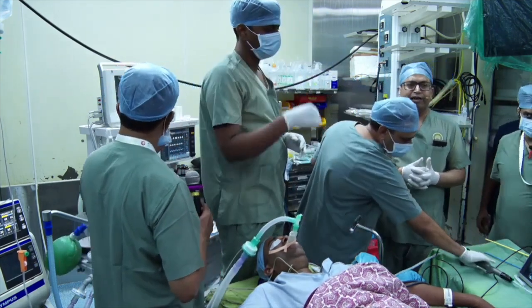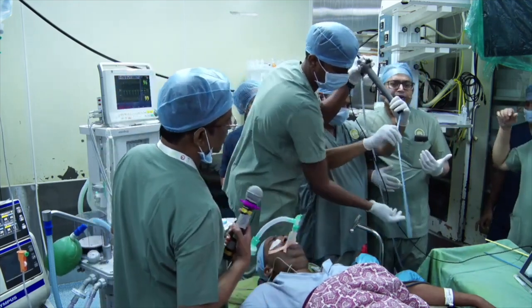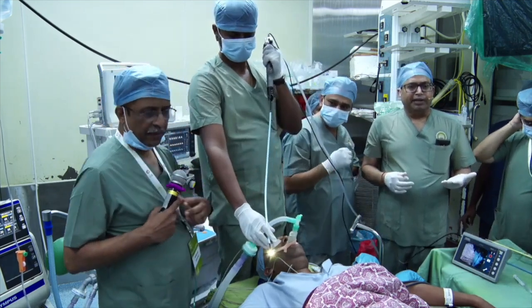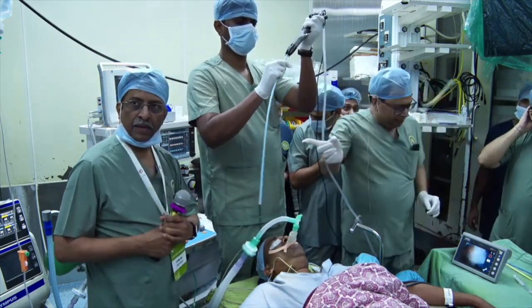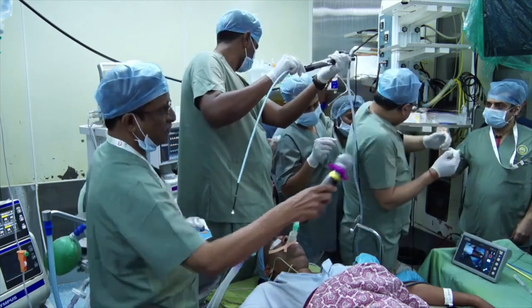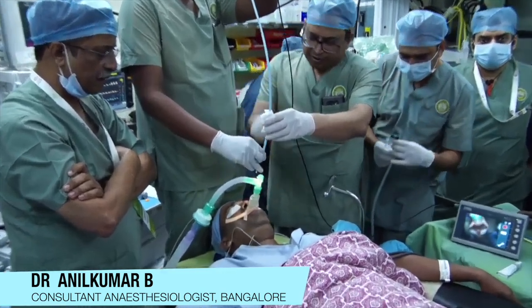If the surgery needs a definitive airway — for example, a patient for laparotomy — and you need to paralyze the patient because that's the surgeon's demand, in that case you have to have an endotracheal tube. If it's a life-or-limb saving surgery that requires a definitive airway, you should go ahead in that situation. Make sure you've got a couple of pairs of hands — don't try to do that alone.